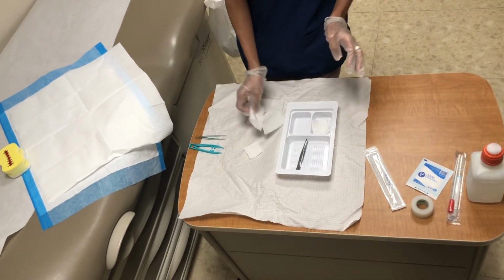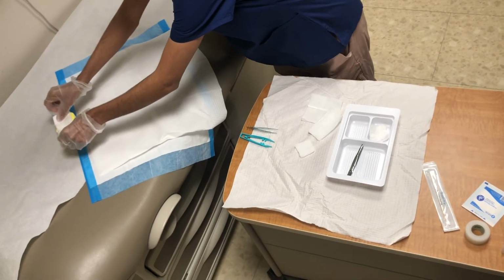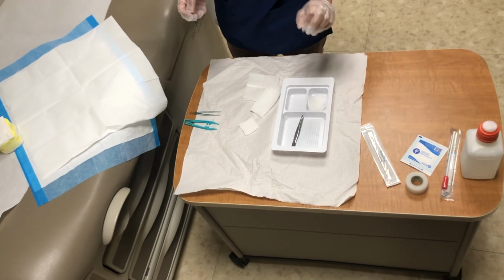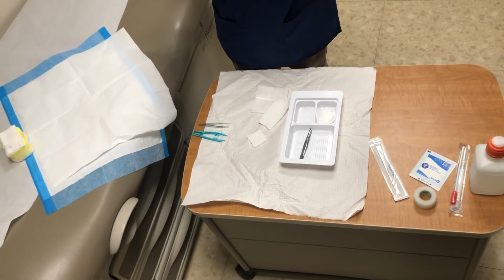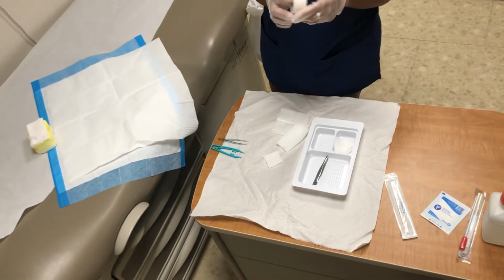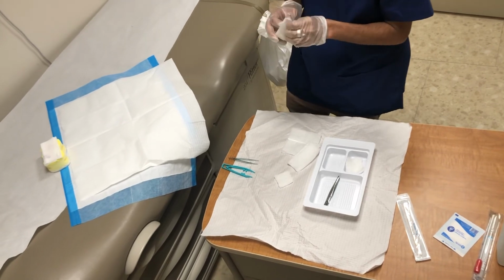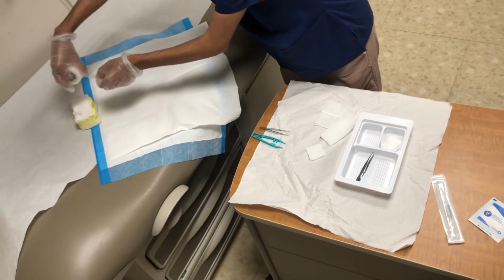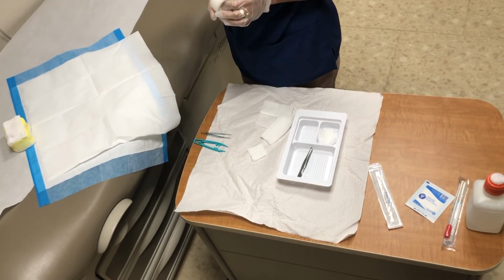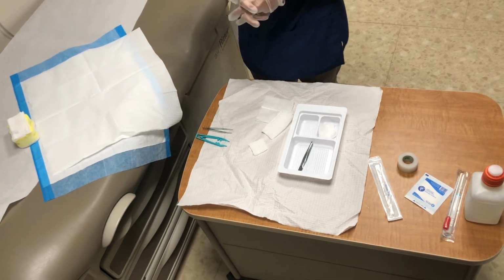So once I've done that, I'm going to cover the wound with another sterile gauze, and I'm gonna leave it like that. And then at this stage, I can either take my gloves off or I can just use the tape like that. So I'm just gonna keep it on. I'll put the date on it, and then I'm going to tape it to secure the dressing. So I've done that. I've done 3 layers and I've secured the dressing.